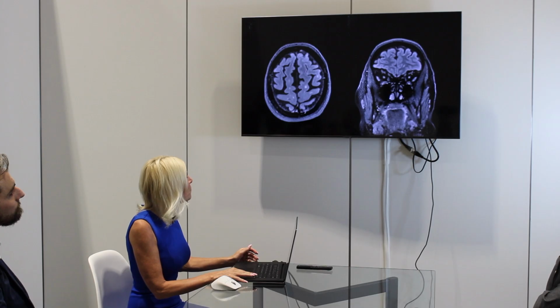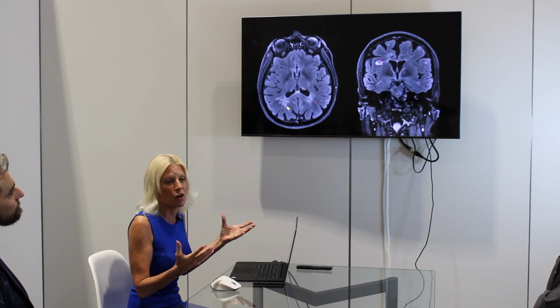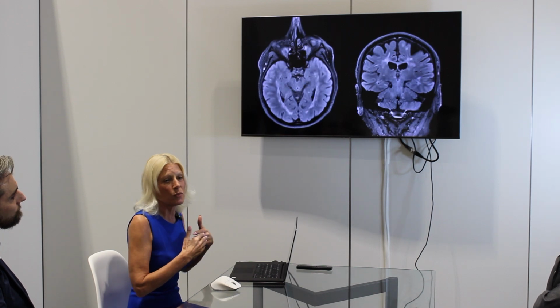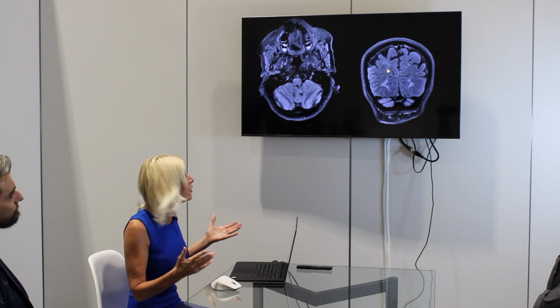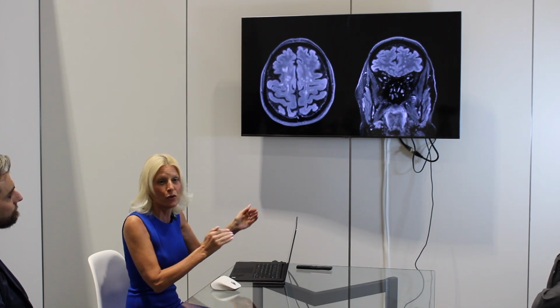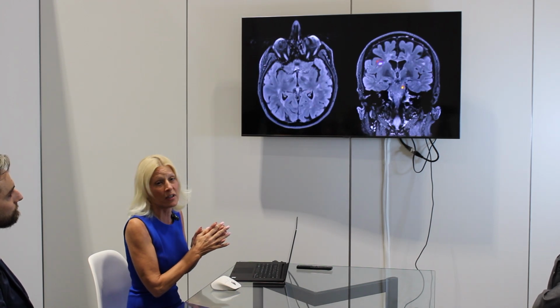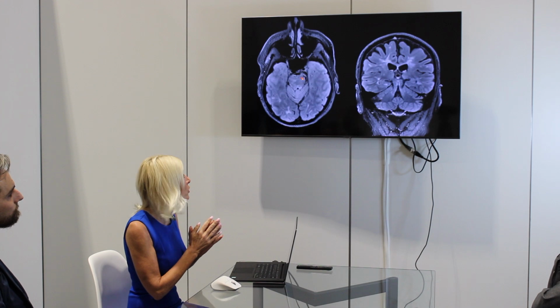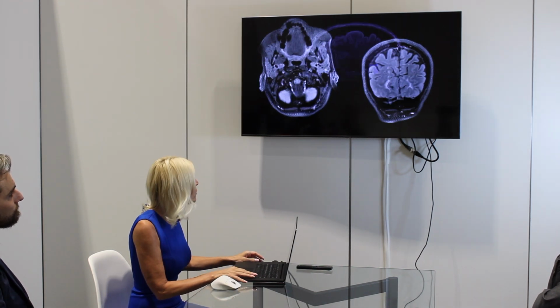And you can see if the patient only has just a couple of plaques, you probably don't need quantitative software. But by the time we see, all these patients get annual follow-up, and they all end up in sort of the moderate or severe category. And it's just so much easier to pick it up when you use quant software. Computers are much better at pattern recognition than humans, although, of course, humans are better at global reasoning. But you can see how this software is extremely useful.